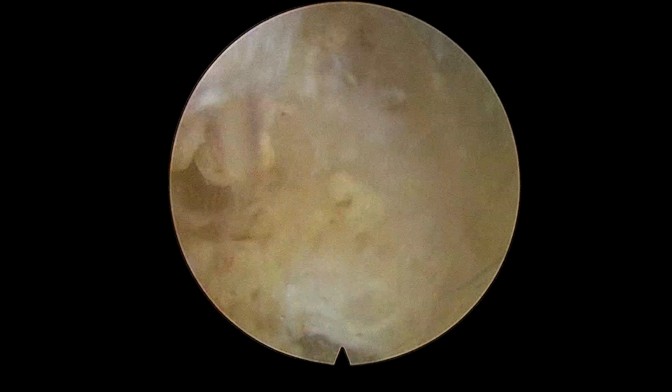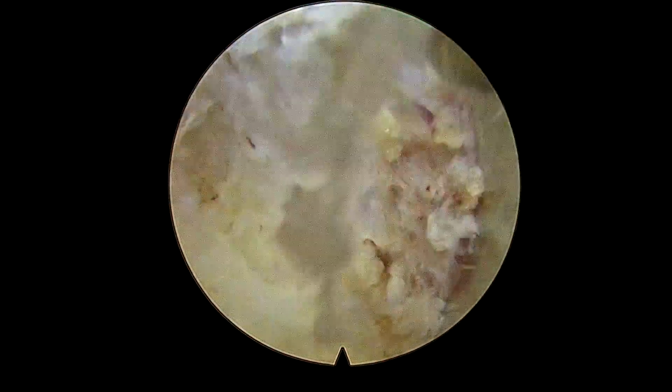I can already see all the bony landmarks here, but I am just removing those soft tissues from the interlaminar space for you to identify the landmarks. This is nothing but the fat lying in the interlaminar area and some soft tissues over the inferior articular process. I am just burning to make the landmarks more clear. It is very important to identify all the bleeding points and coagulate them.